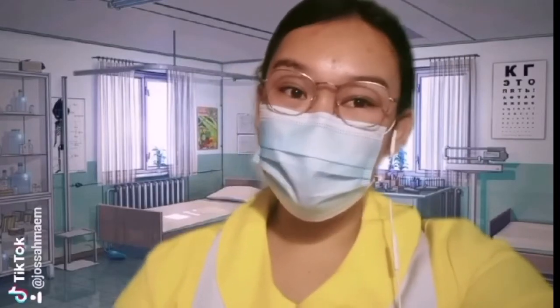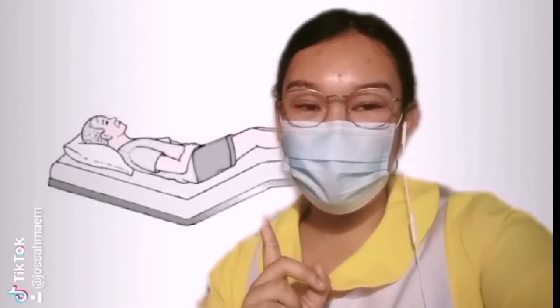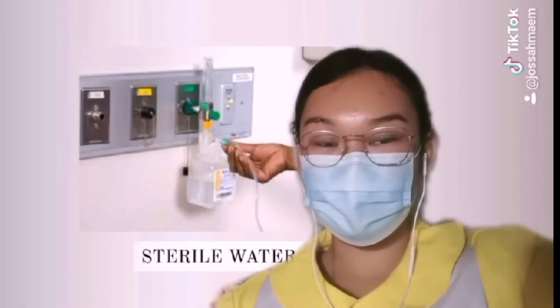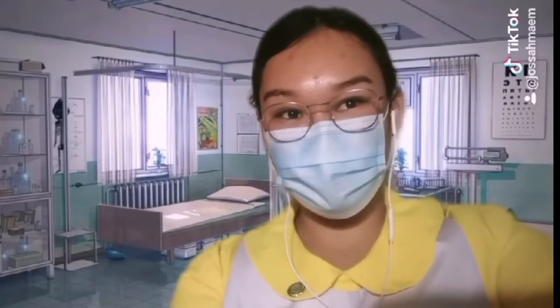Set the bed to a comfortable height and lower the side rails where you will work. Next is to position the client in a semi-Fowler's position. Next is to attach the nasal cannula to the oxygen with a humidifier. Turn on the oxygen flow rate until bubbling is noted. Next is to regulate the flow rate as prescribed, in liters per minute.